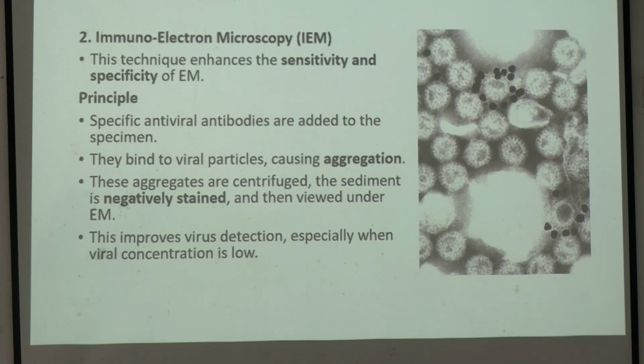If the rotavirus is present, the gold nanoparticle along with the antibody sticks to the antigen. Okay? So, now we can demonstrate the gold nanoparticles in the microscope. So, that is why the exact location of the virus is found.